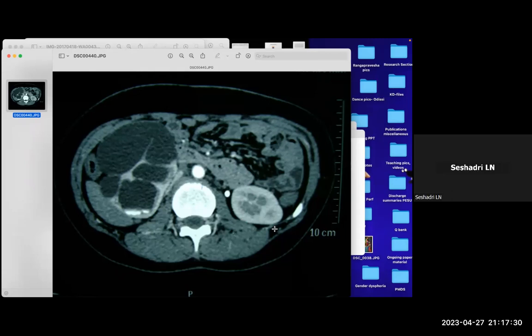So it's contrast enhanced, and you can see some dilatation. You can see some fullness of the calyces. Then what else are you seeing? What is this? Aorta. Where is the other large vessel? IVC. Where? Left renal vessel. Appears to be compressed, sir. Okay, that is compressed.